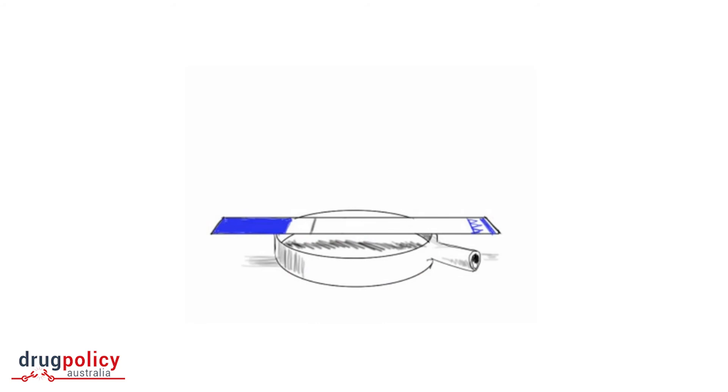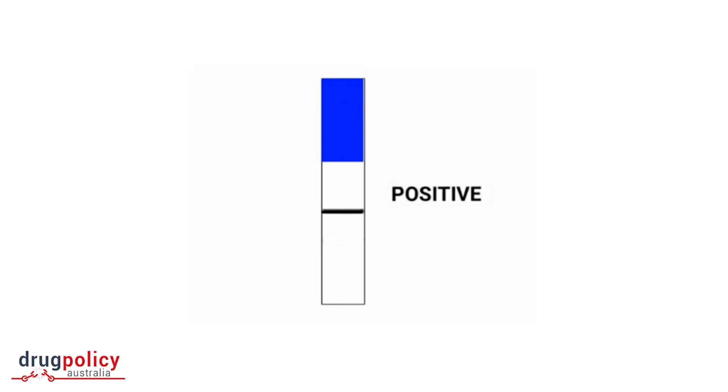Onto the results. One line is positive for fentanyl and two lines are negative. The drawback is unfortunately they don't tell you the percentage of fentanyl present, but knowing is half the battle.